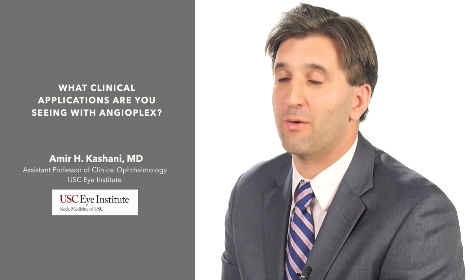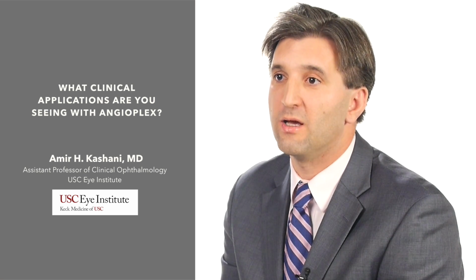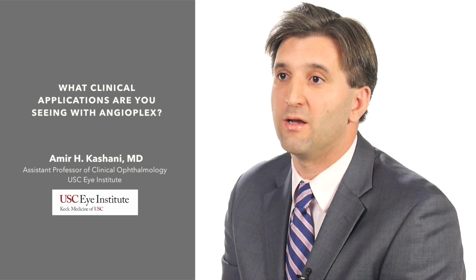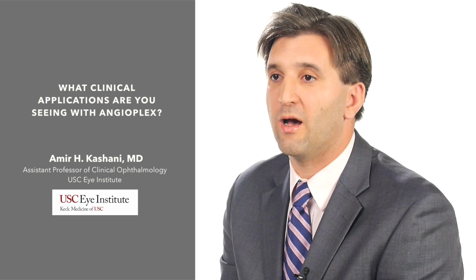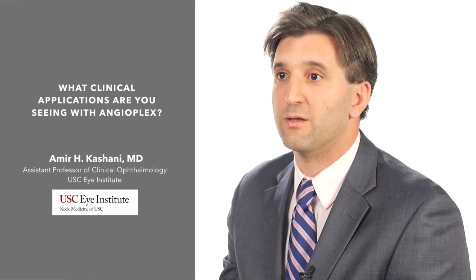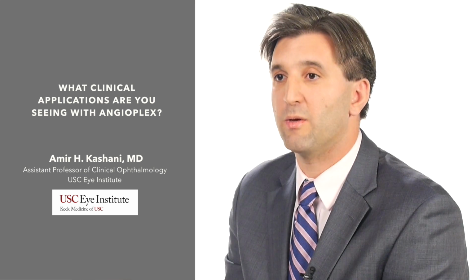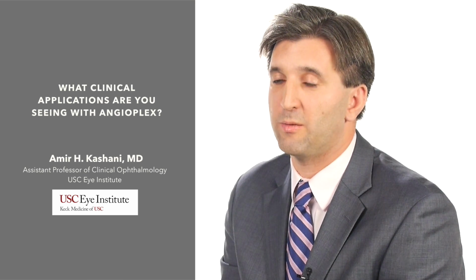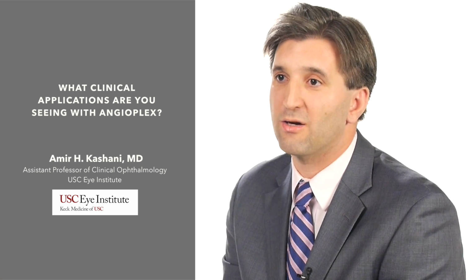So another example of where we can use AngioPlex to look at retinal vascular diseases is retinal venous occlusions. Oftentimes patients with retinal vein occlusions will have an occluded vein that results in intraretinal hemorrhages and intraretinal edema, as well as macular ischemia. On fluorescein angiography, we need to do it repeatedly to be able to see where the macular ischemia is. But with OCT angiography, it'll be easy to follow the macular ischemia more regularly to see if the injections are improving or not improving the macular ischemia. And that's actually an important question in the field now, because we're not able to measure that as carefully as we'd like to.